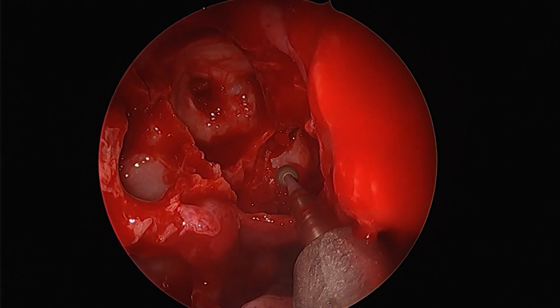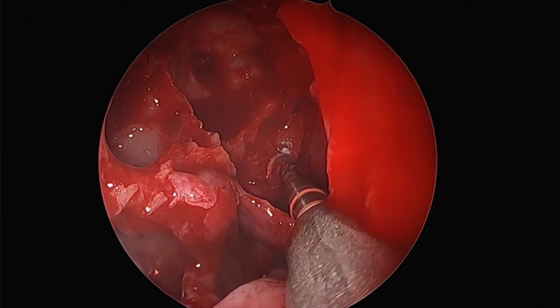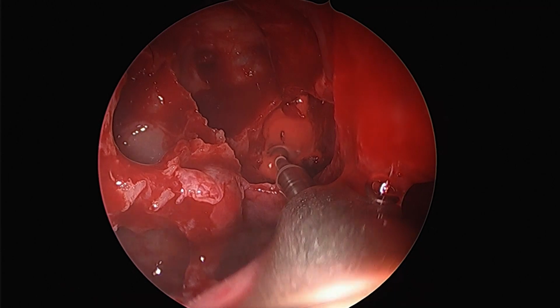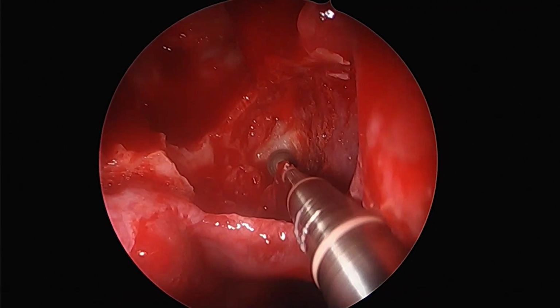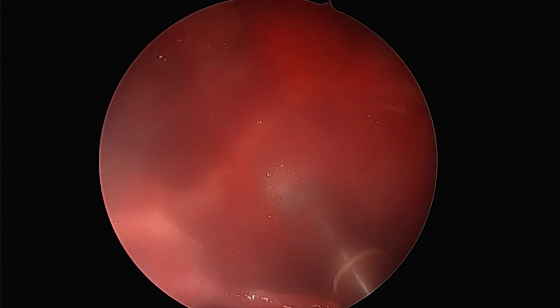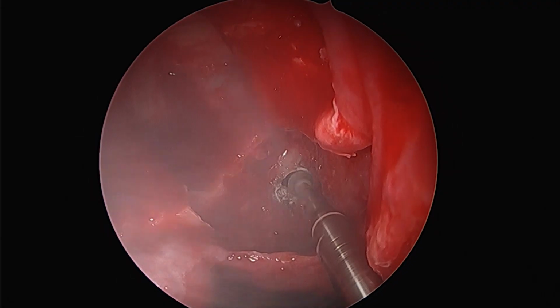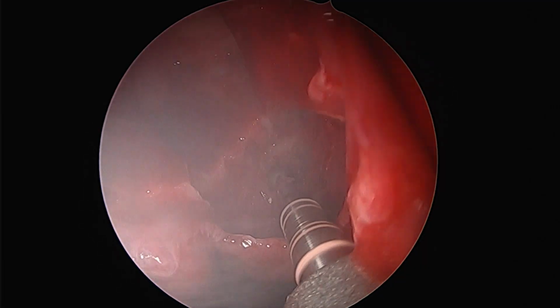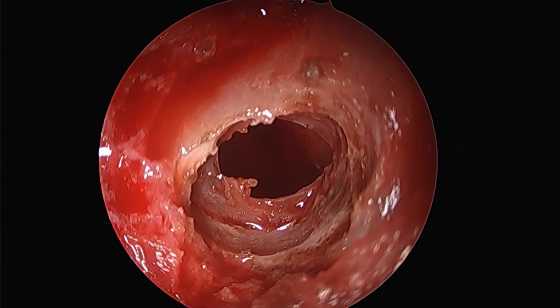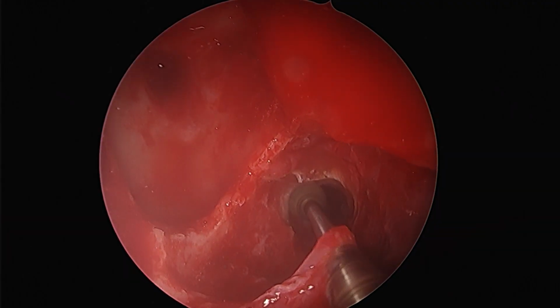Now we resort to using a drill, which is a very uncommon situation for us as well. In case it is not being opened, we resort to using a standard nasal drill and drilling on the approximate location of the sphenoid ostium, which is, like I said, around 1.2 centimeters above the choanal arch, strictly towards the midline, close to the septum. Again, taking care not to make a straight shot hole, but to use gentle motion of the drill to be able to locate the entry into the sphenoid sinus. And like you can see now that the entry has been made, but it is still small. So the entry is now being enlarged. We can already see that the sinus is opened, but we are just slightly enlarging the entry.